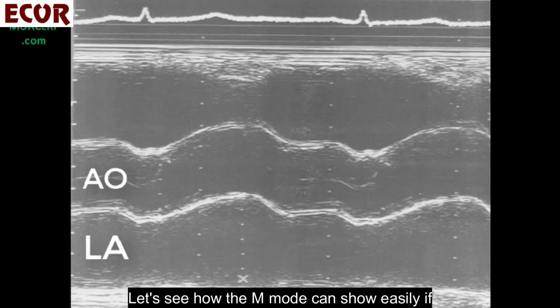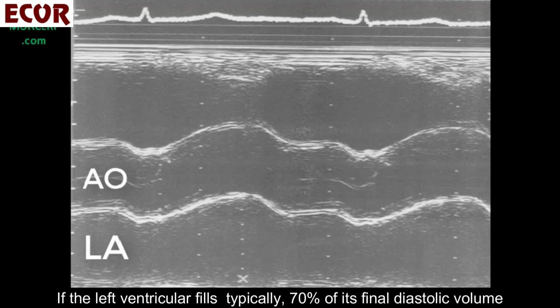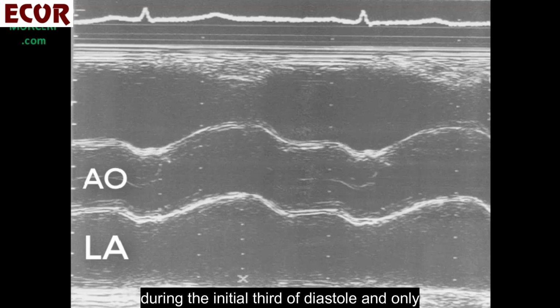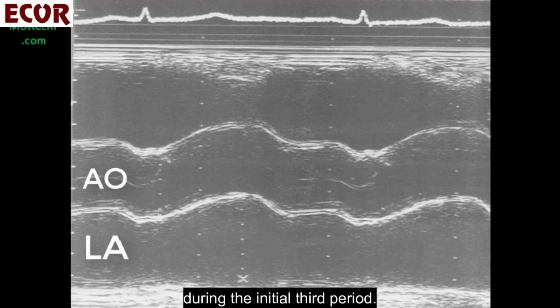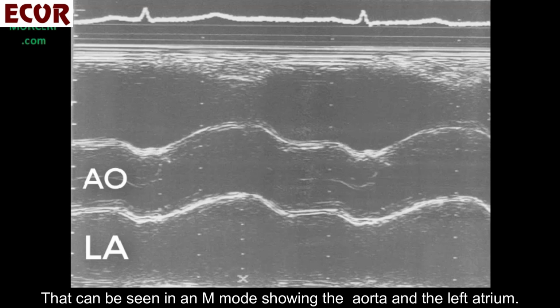Let's see how the M-mode can show easily if the relaxation of the left ventricle is normal. If the left ventricle typically fills 70% of its final diastolic volume during the initial third of diastole and only 30% during the last two thirds, it is evident that the left atrium empties much more during the initial third. That can be seen in an M-mode showing the aorta and the left atrium.